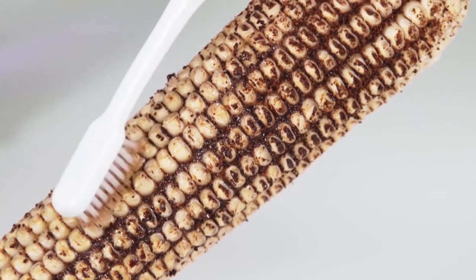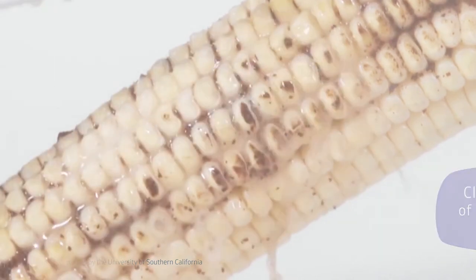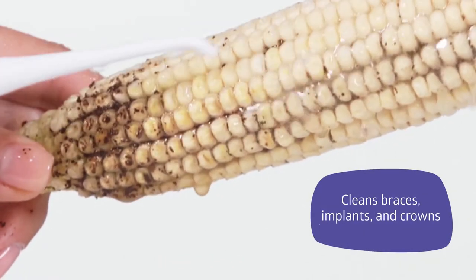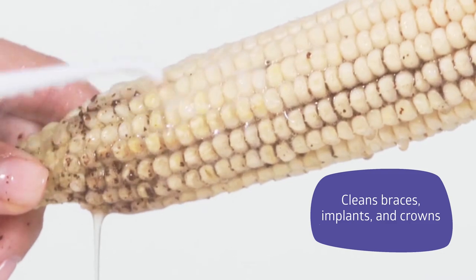Let's compare the operation of the Be Well Irrigator and a regular brush. The irrigator clears 99.9% of bacterial plaque in just 3 seconds. Be Well WI 911 cleans even the hard-to-reach places. It is the most effective irrigator for cleaning the mouth cavity.